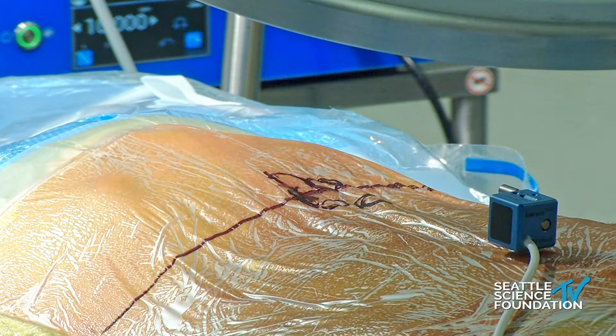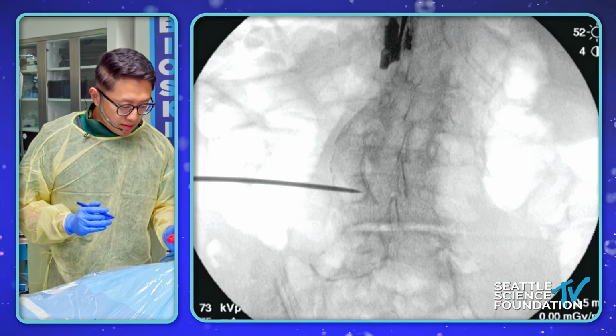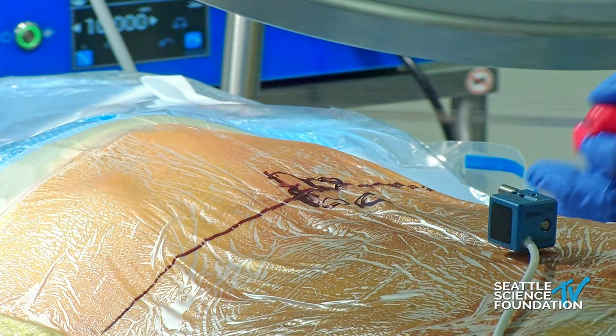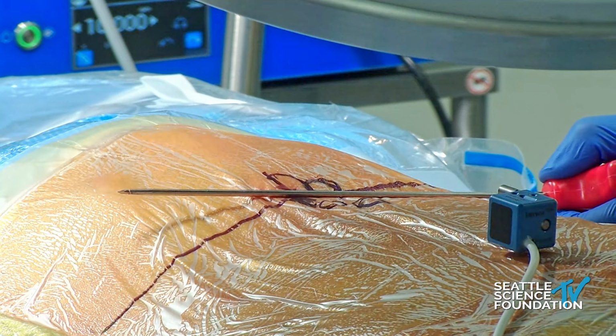And all these endoscopes are about 20 to 30 degrees working angle. And so you can really look around the corner. And so again, the key is we want to get to basically the medial border of the pedicle below and the posterior vertebral body. And typically you take a little bit of a cranial caudal trajectory, and that's how you stay away from the exiting nerve root.